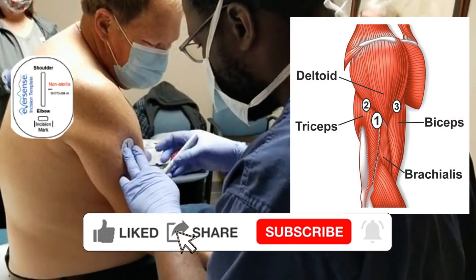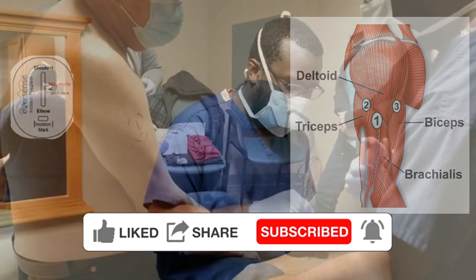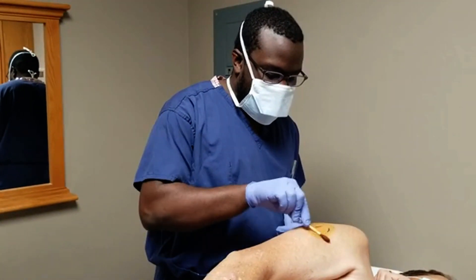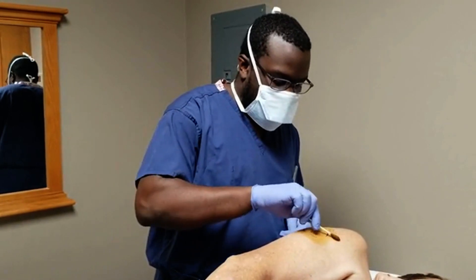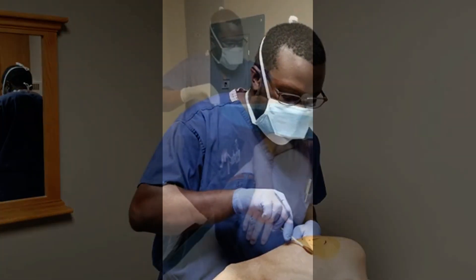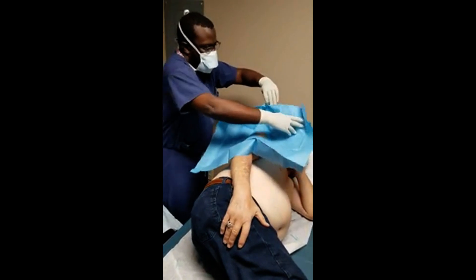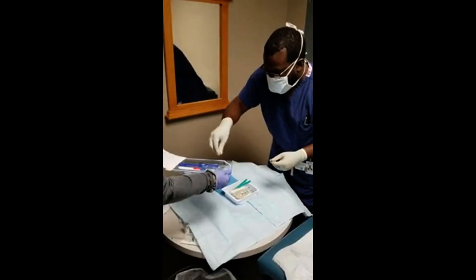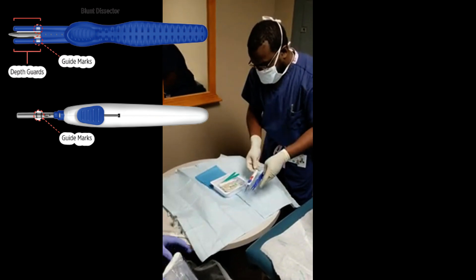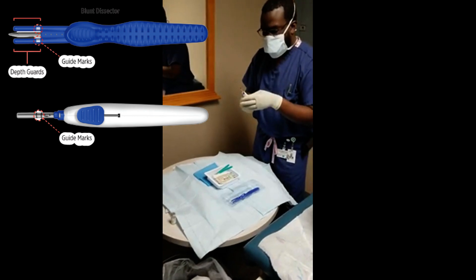The ideal location for sensor insertion is the fossa between the triceps and the brachialis, just caudal to the deltoid muscle, but you can place it more anterior or posterior for patient preference. We place the patient in the lateral position, make sure they're comfortable, and clean the area very thoroughly with skin prep. We then drape the patient sterile. It's important to have a great assistant who can pass you the tools into the sterile field. Eversense has created some tools which will help you place the sensor, and we're going to go through them in this video.